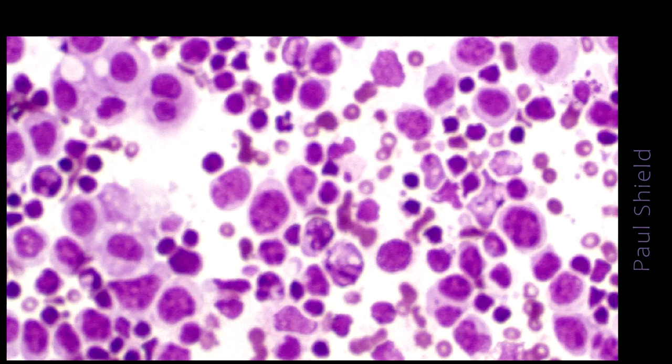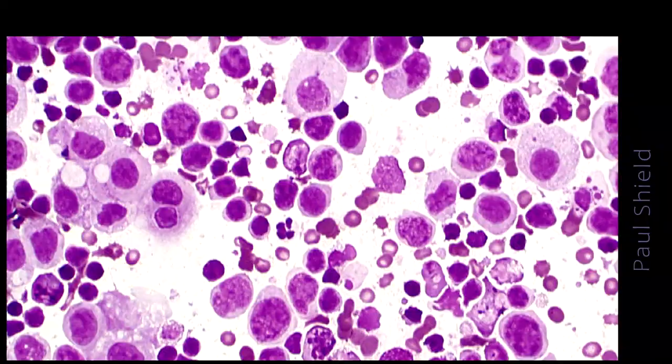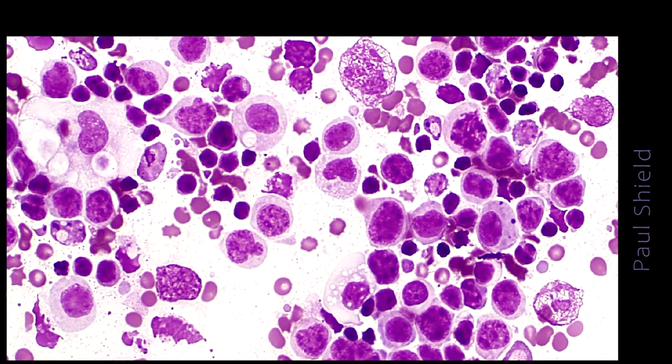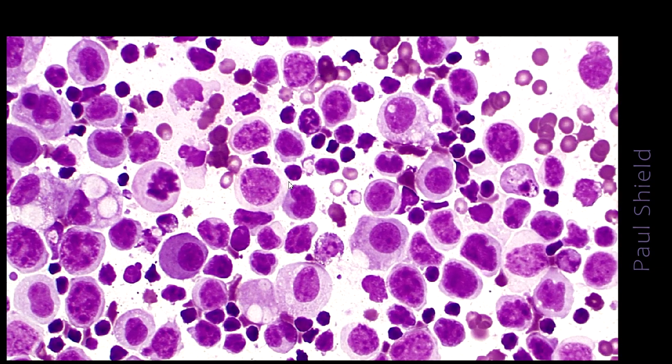And notice how they have quite an irregular outline to the nucleus. There are indents, lots of sort of bum cells like this, and projections on them. They definitely have a little rim of lymphoid looking cytoplasm on them.